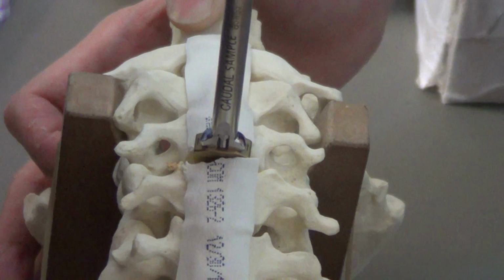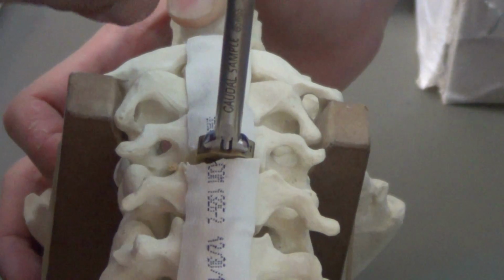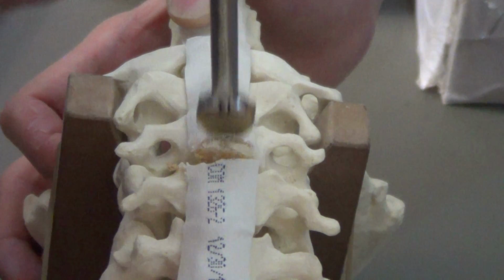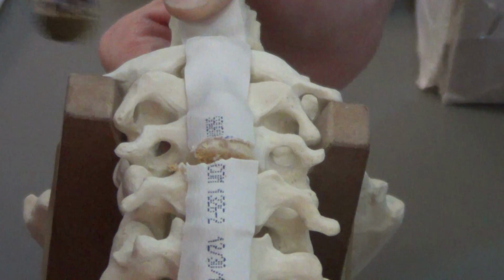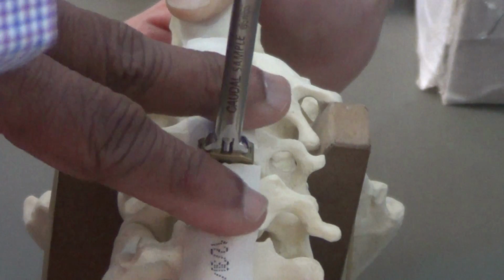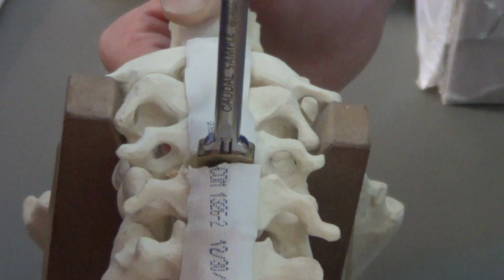And when you release the distraction, if you find that it's too tight, and if you put too long a cage, or if the cage is too big, then what happens? There is separation of the posterior joints. So that is not ideal. You must put the ideal type of cage which is snugly fit, and after you remove the distraction with the distraction pin, then you find that the cage is very stable there.